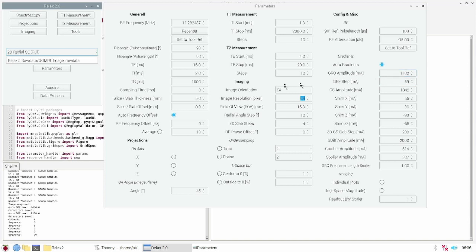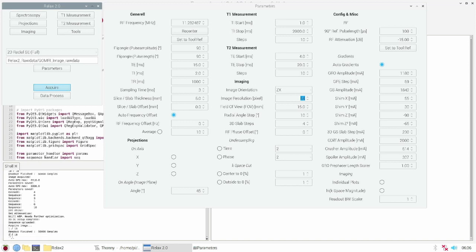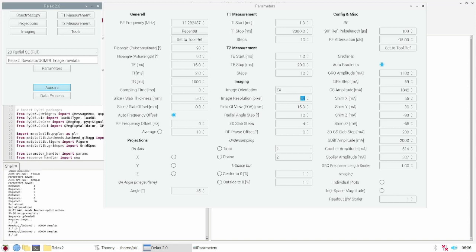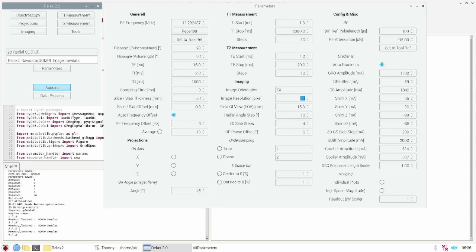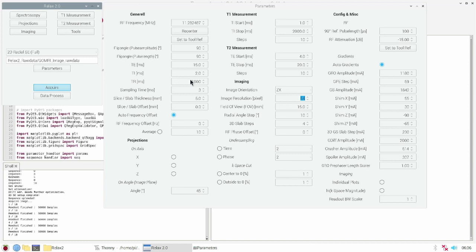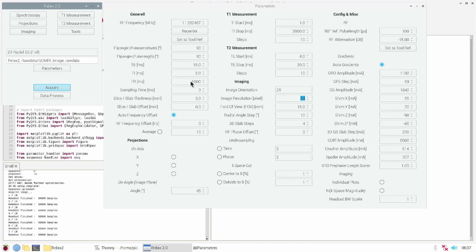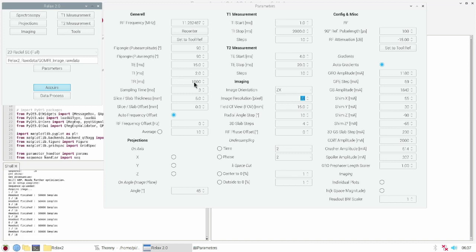When finished we click acquire and you will see the Ocra acquires the data. This will take a while, exactly the steps times the repetition time, which is set to one second.